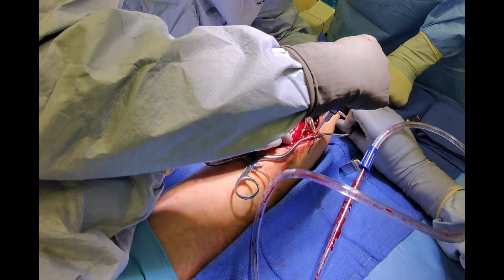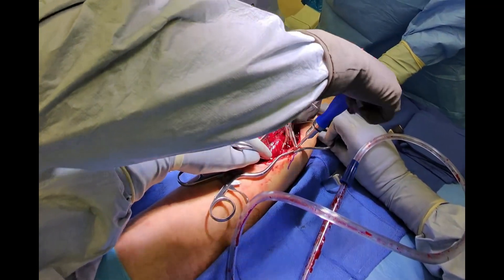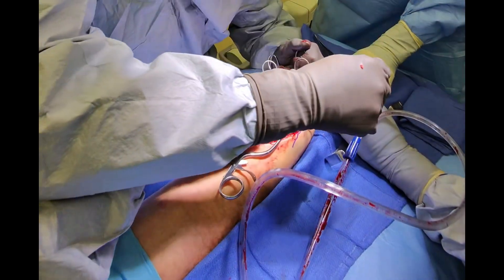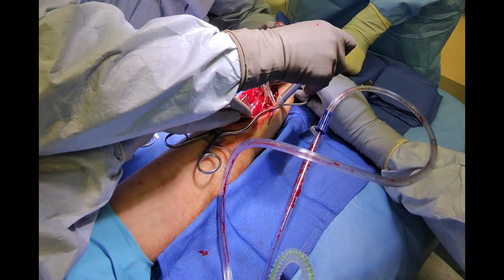A tool called a countersink is used so that the screw will sit against the bone edge without prominence. We use the depth gauge to measure the length of the drilled hole in the bone.